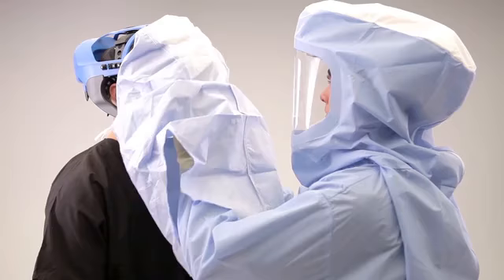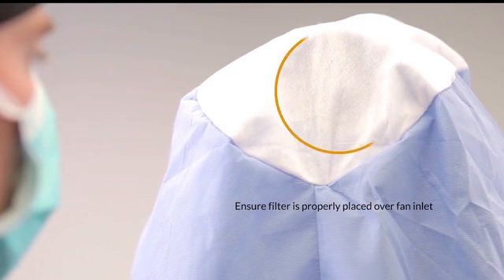Carefully pull the hood up and over the helmet. Then grasp the inside of the hood and pull the hood completely over the rear of the helmet grille, and ensure the filter is properly placed over the fan inlet.